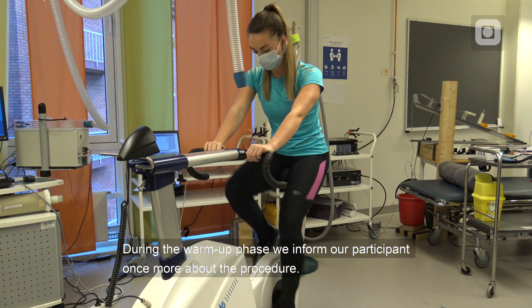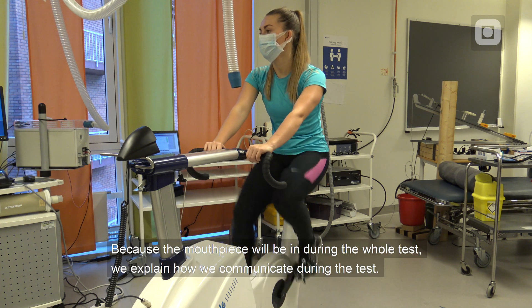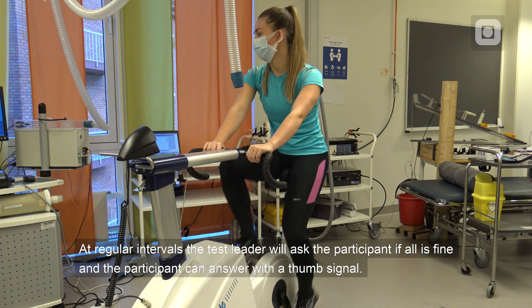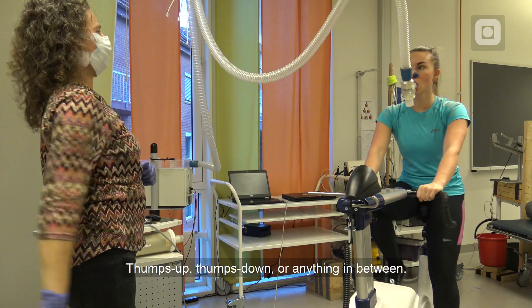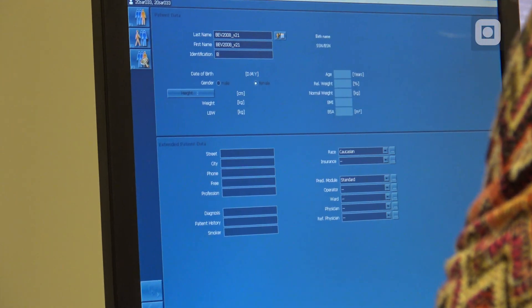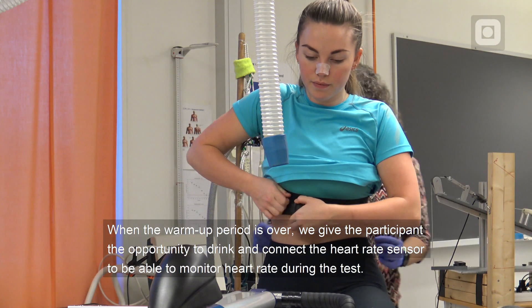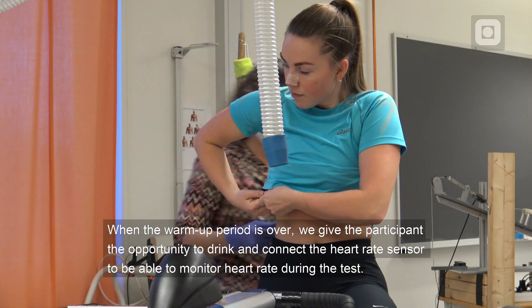During the warm-up phase, we inform our participant once more about the procedure. Because the mouthpiece will be in during the whole test, we explain how we can communicate: at regular intervals, the test leader will ask the participant if all is fine and the participant can answer with a thumb signal — thumbs up, thumbs down, or anything in between. This is also a good time to fill in the participant information in the software: name, identification, date of birth, gender, height and weight are required. When the warm-up period is over, we give the participant the opportunity to drink and connect the heart rate sensor to monitor heart rate during the test.